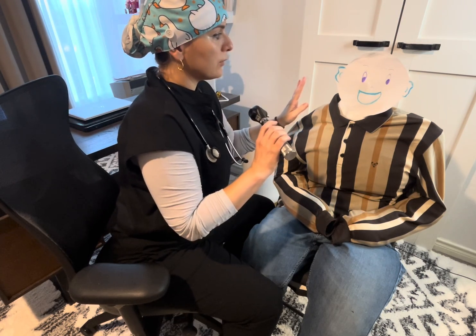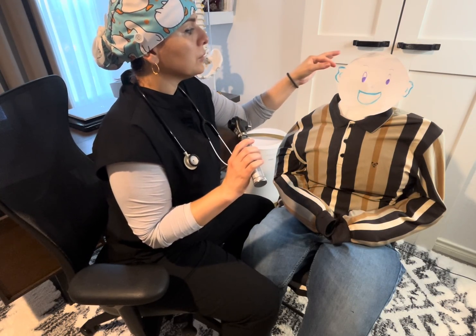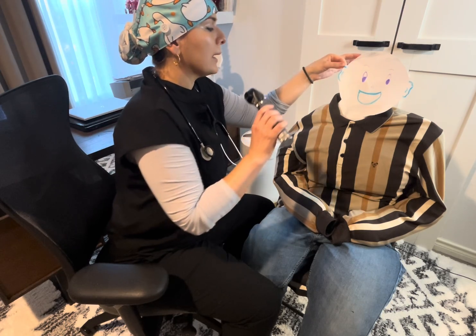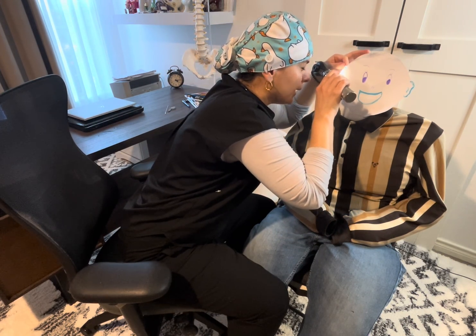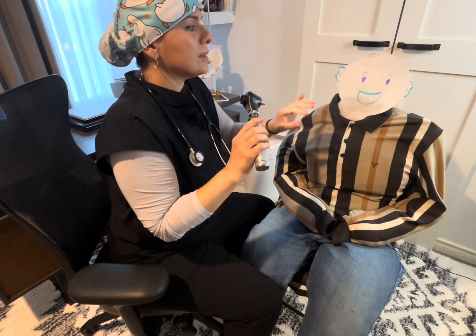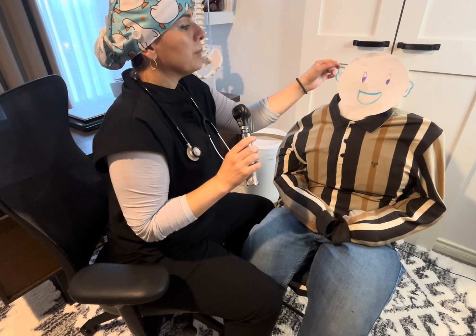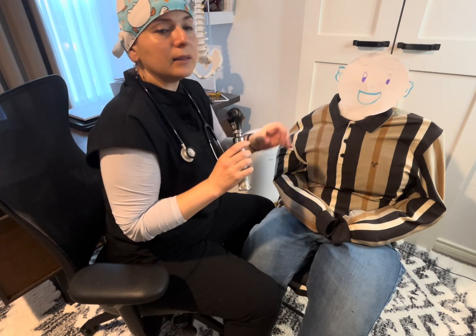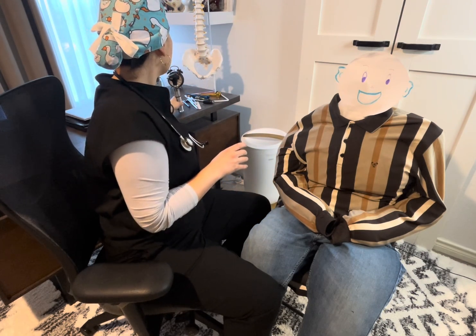In adults — and this is really important — we have to pull the pinna up and back, and then look into the ear canal. In children, however, we pull the pinna down and back, so that we can see the ear canal better.